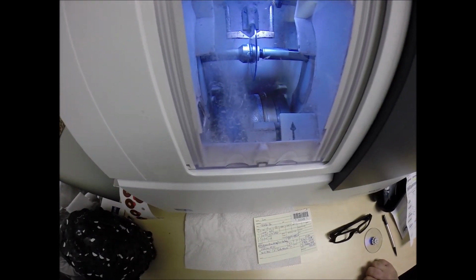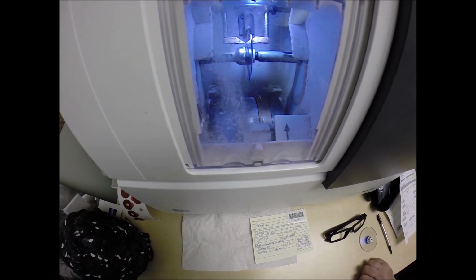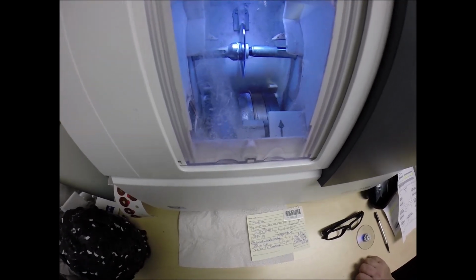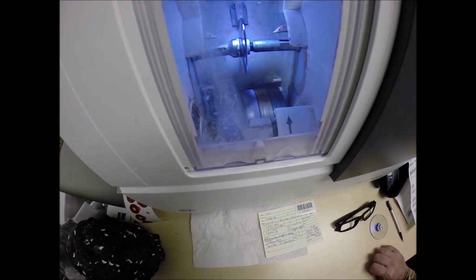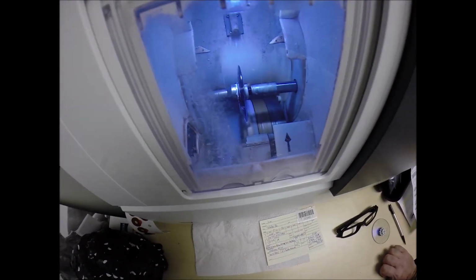And then measuring the thickness of the lens at every point to know exactly and precisely where to place the bevel for the least amount of edge thickness to show. Essentially the best cosmetic look possible. Of which you're not going to have any edge thickness anyway, but I do cut very strong prescriptions all day long for free, and that is a little bit more critical with the higher powers.